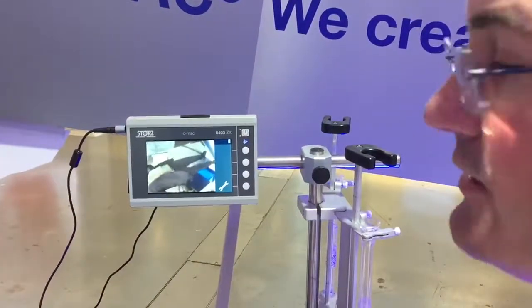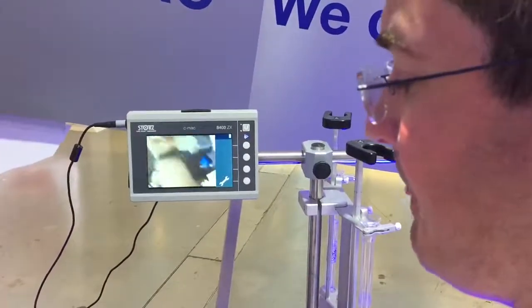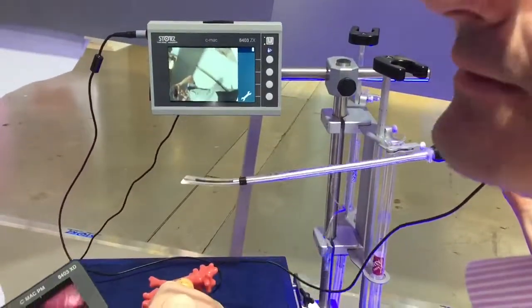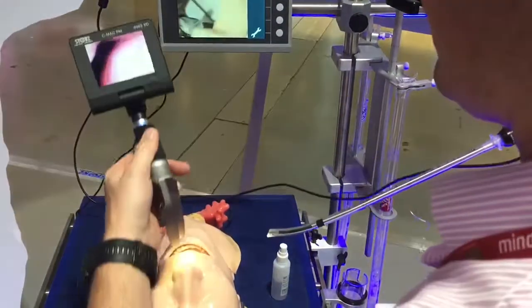The principle of dual endoscopy is that it gives you multiple layers of protection. So, you're using your video laryngoscope or even a normal laryngoscope and you're using your intubating scope — either Bonfils, video stylet, etc.